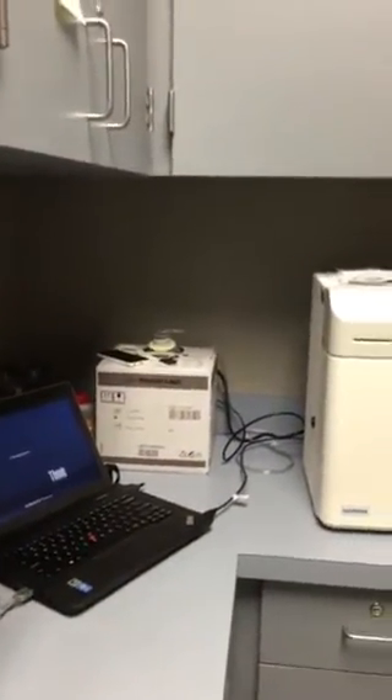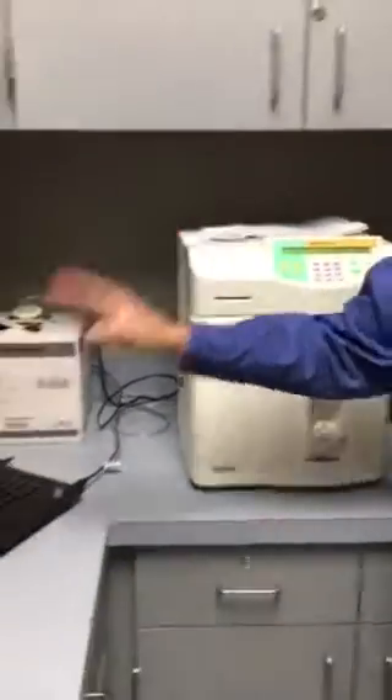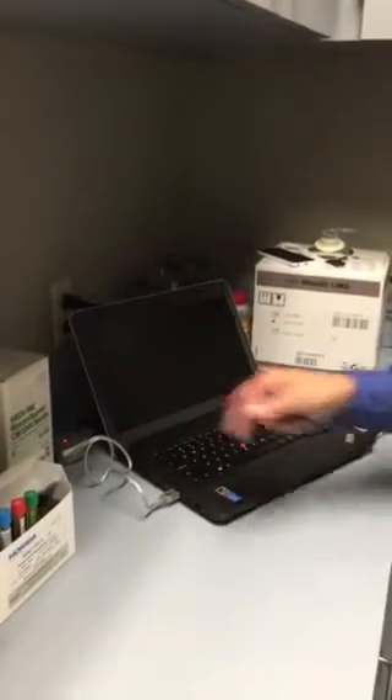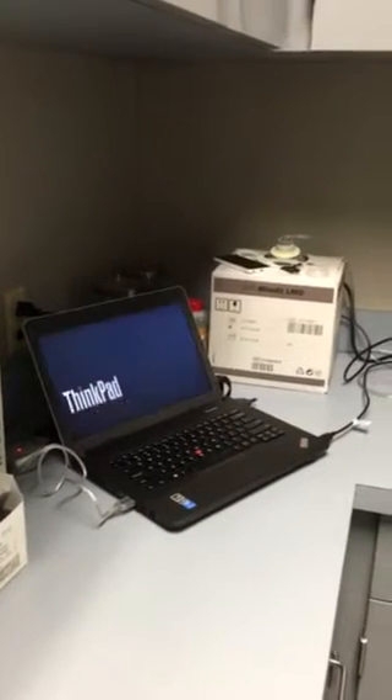This is the analyzer, and we send data out to the laptop — your QC, your patient data, and your startups. All of that is sent to the laptop, and that's where it will be stored. You want to bring the laptop up first.